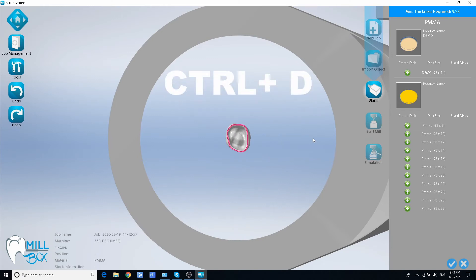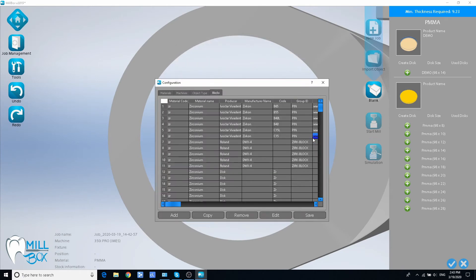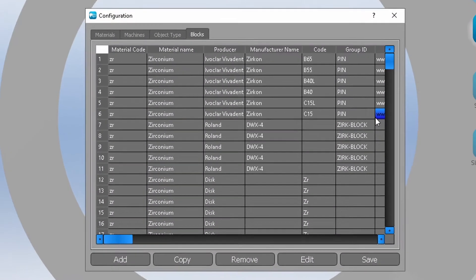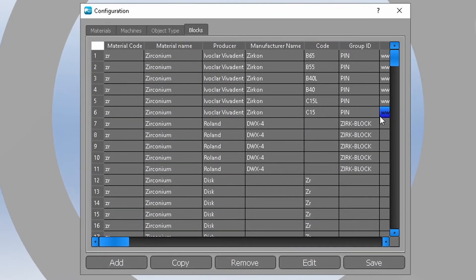On your keyboard press CTRL plus D buttons and in the open window click on blocks bookmark.